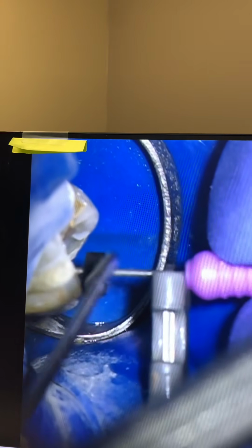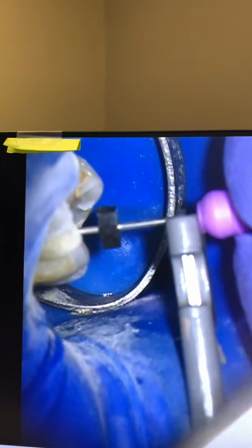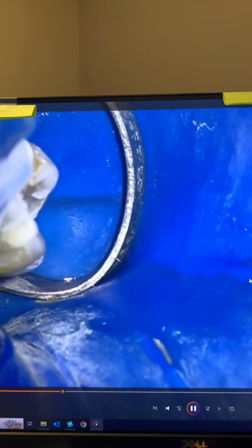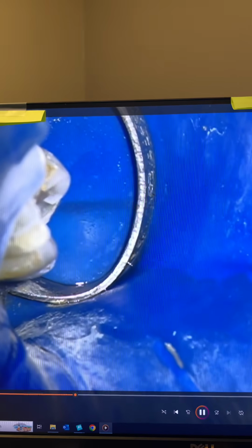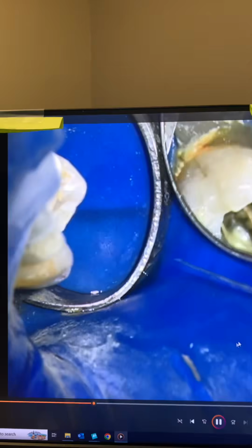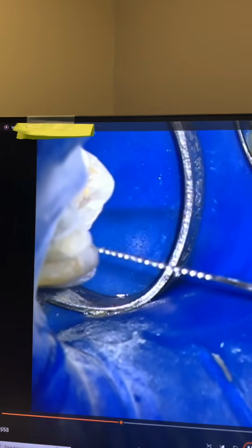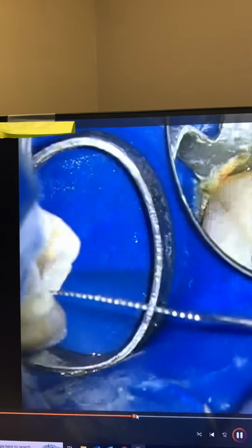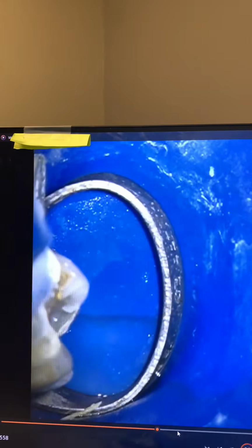So let's see what the MB1 is here. That is 23 and a half. MB1. So I'm gonna fast forward. We basically are getting the working lengths here. The working lengths were between 23 and 25 millimeters. So let's just fast forward here.